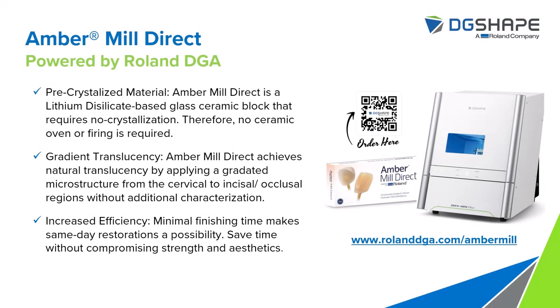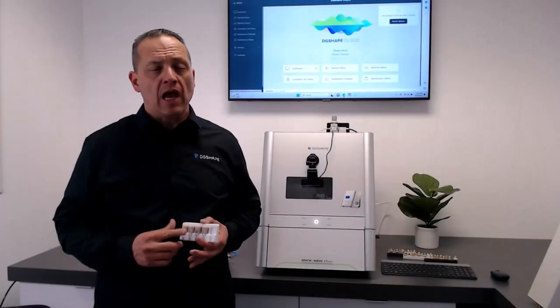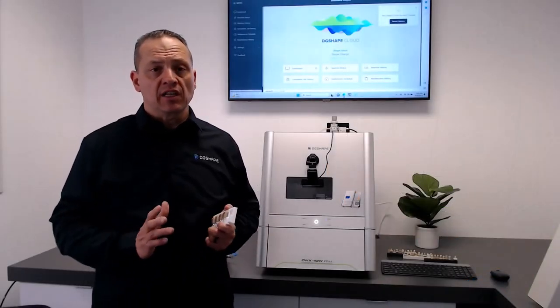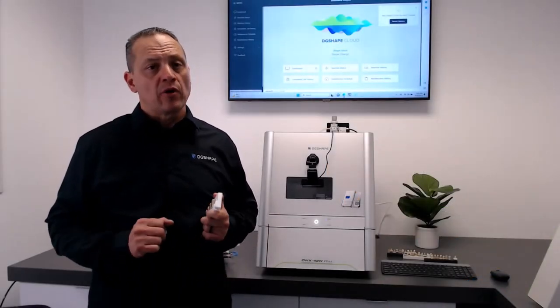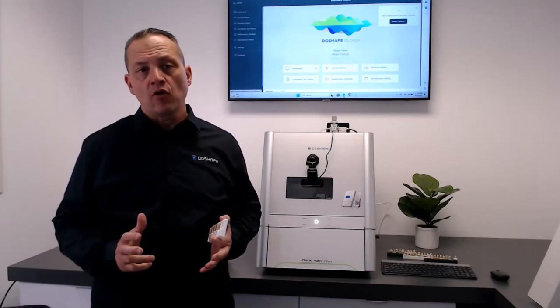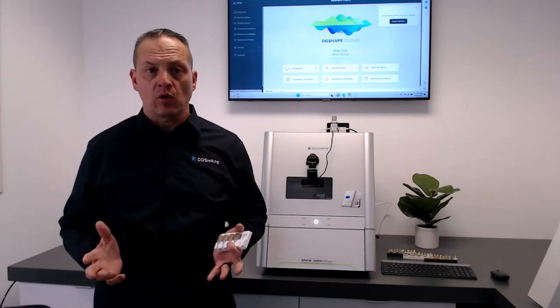Amber Mill Direct, powered by Roland DGA. Pre-crystallized material. Amber Mill Direct is a lithium disilicate based glass ceramic block that requires no crystallization. Therefore, no ceramic oven or firing is required.